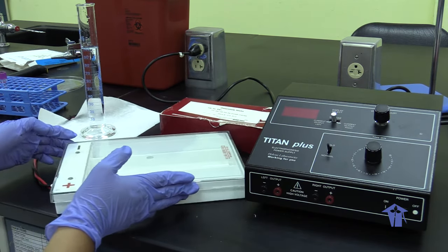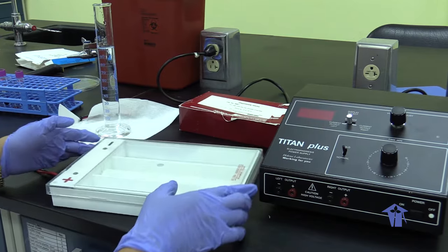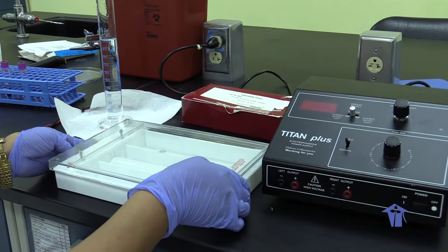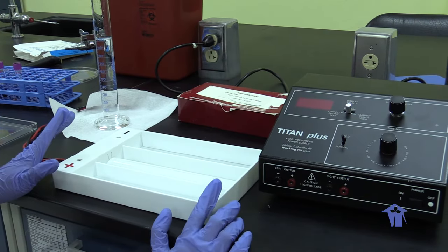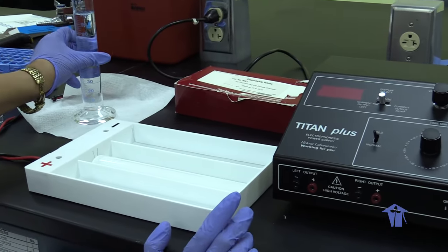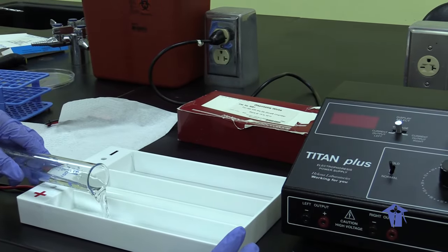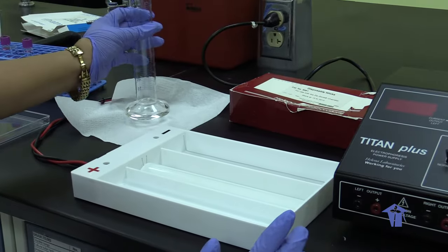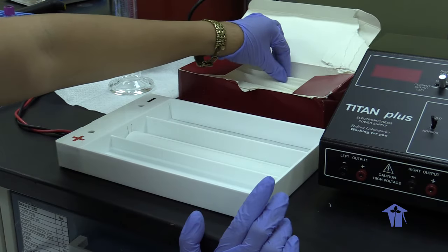The manufacturers place something here, and that's where you're going to put your thumb, and your index finger goes underneath. Able to remove. The buffer goes to the outer chambers, and 100 milliliters of the buffer goes into both sides.